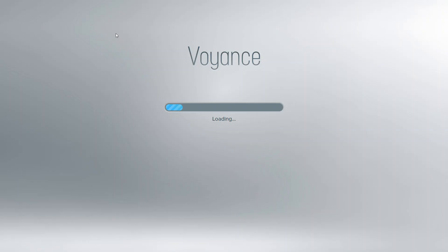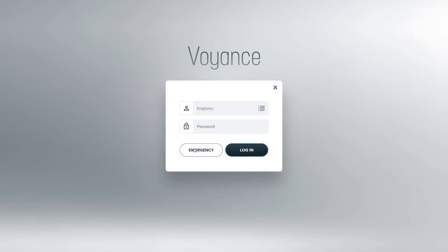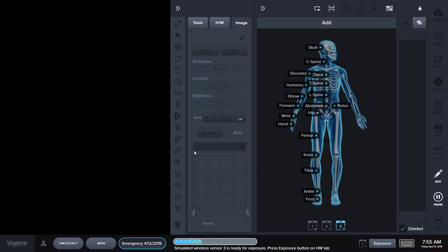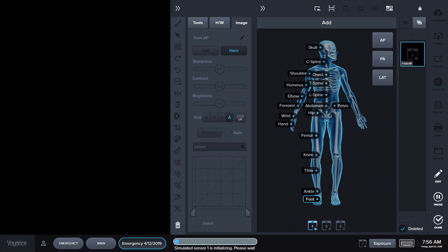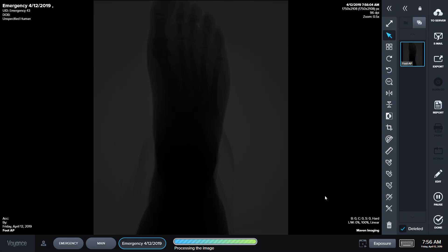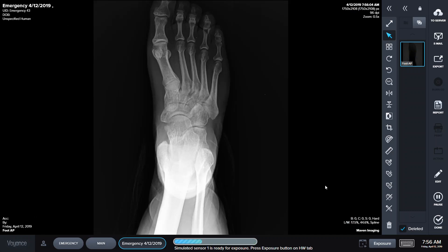First, we double-click on the Voyance icon. We click on Emergency. We click on the foot. We click on the procedure. We click on Expose. And the image comes up.